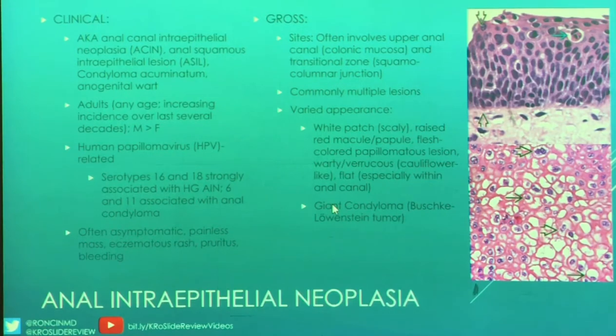The bottom picture is showing you what I feel E was likely looking for, which is the coilocytes. So what you can see is that they have that clearing around the nuclei. The nuclei should be enlarged, which I guess we're going to recapitulate all this on the next page, but it's nice when you can see the picture. And they tend to have this raisinoid appearance where they're kind of wrinkled or crenellated.